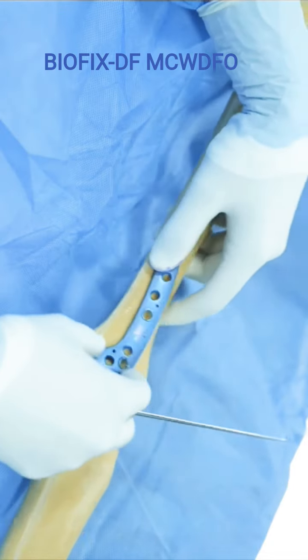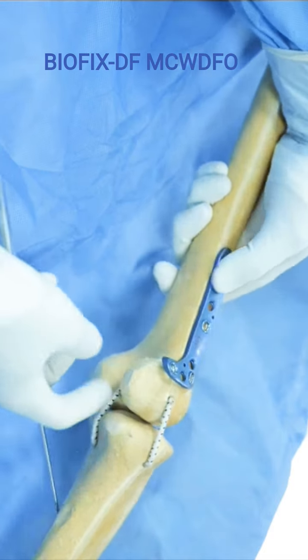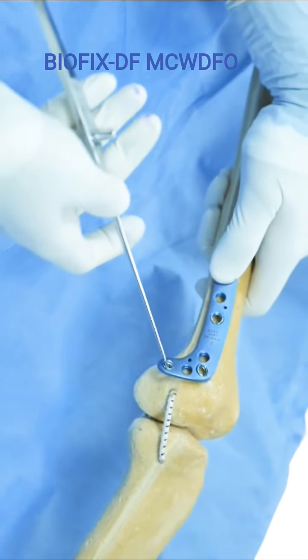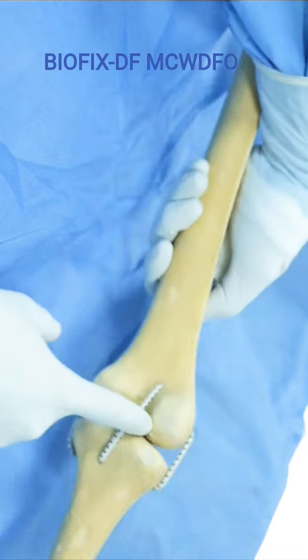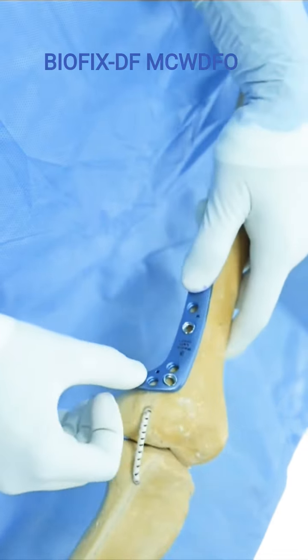Now this is the variable angle screw. This is the variable angle screw, which if not placed correctly, the screw might sometimes get into the notch area here, and therefore it is very important to change the orientation of this screw. And all these screw trajectories are such that they will all be appearing proximal to the notch area here. So we will not be disturbing any intra-articular structures in that manner.